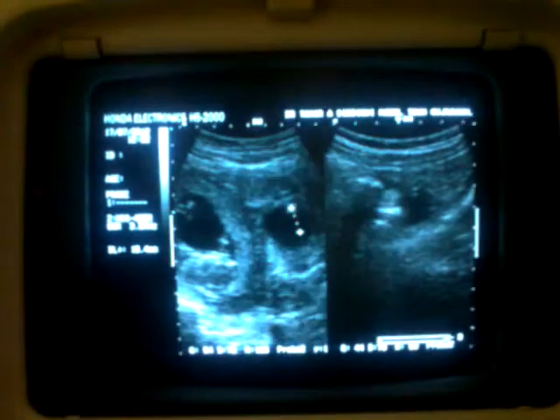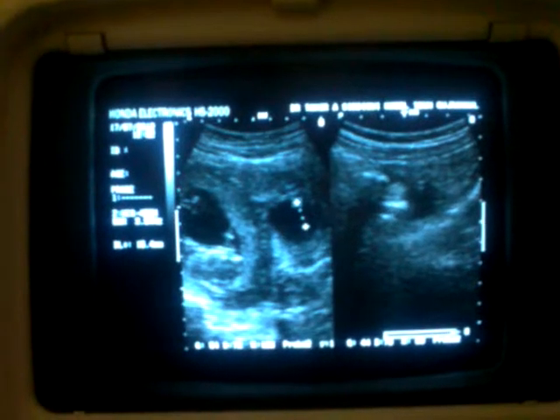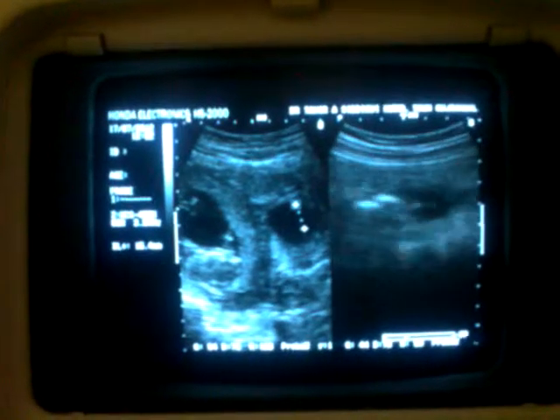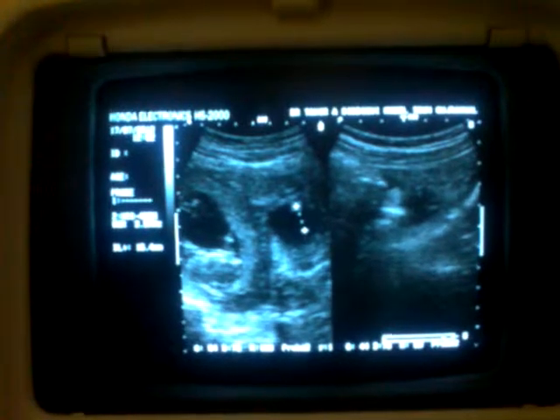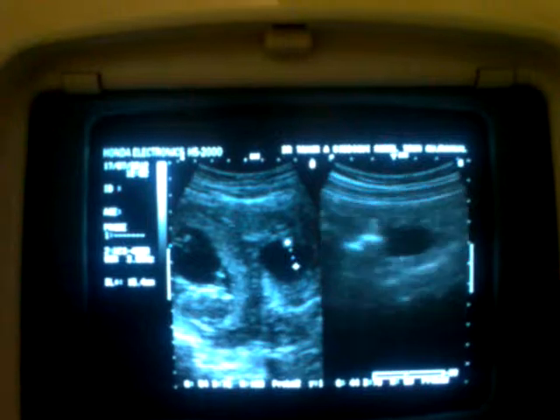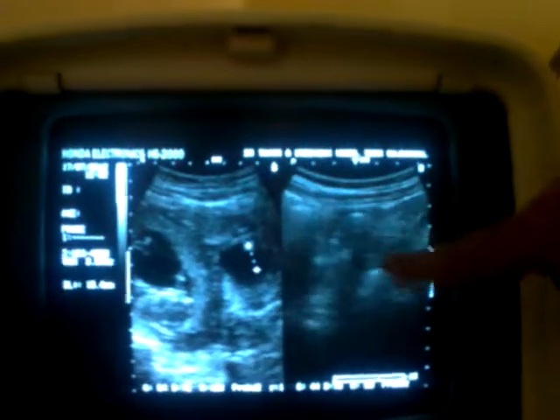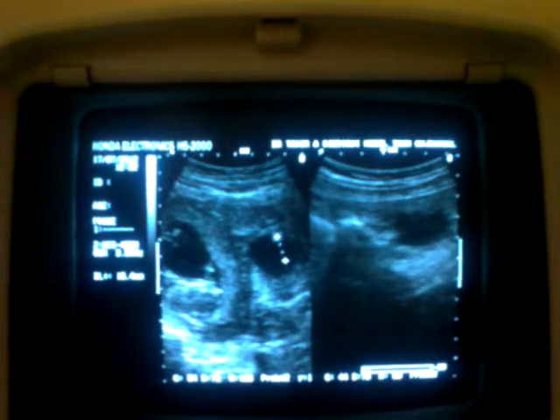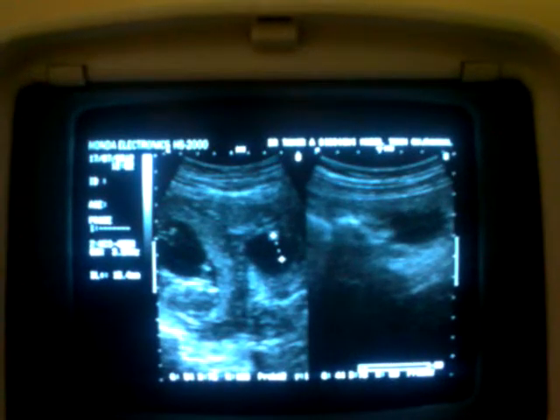Whereas we saw the third sac that was deformed, D-shaped, and had a broken echogenic rim, with fluid seen traveling from the pelvic cavity around the anterior abdominal wall into the hepatorenal angle, Morrison's pouch, as well as in this left paracolic gutter.